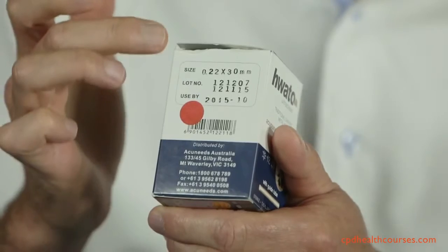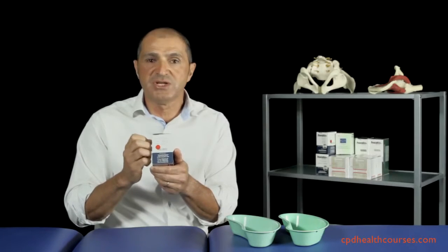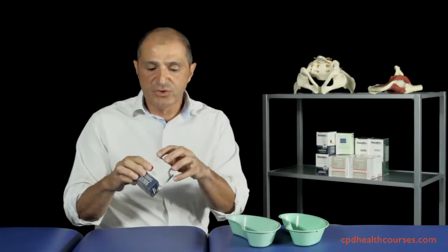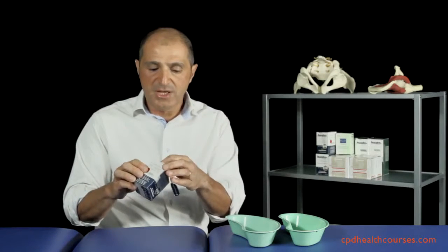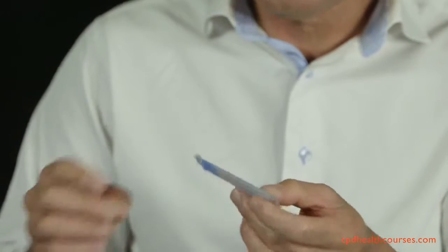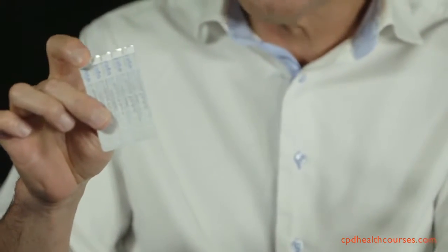That means that the gauge of the needles is 0.22, that means the diameter of the shaft, and the length of the needle is 30 millimeters. Let's have a look inside the box and show you how the needles are presented. Inside the box is 100 needles, but each of these blister packs contains 5 needles, and so there's 20 of those making 100 needles.